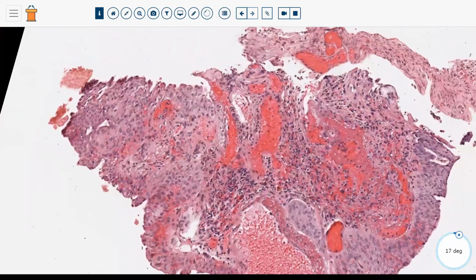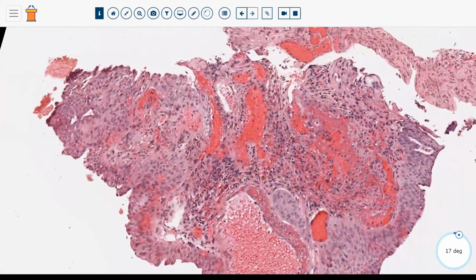The vast majority of patients with pseudocarcinomatous hyperplasia have been treated with radiation, usually for prostate cancer. However, some of the studies that have looked at this process found occasional patients with other associations, like severe vascular disease or sickle cell disease. In other words, they have something that would likely cause vascular injury and could be resulting in this pattern in the bladder. But this particular slide was labeled as a patient who had radiation cystitis.